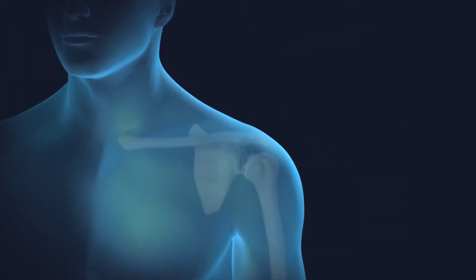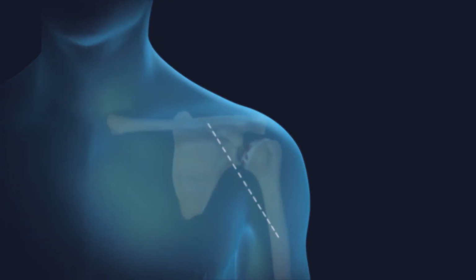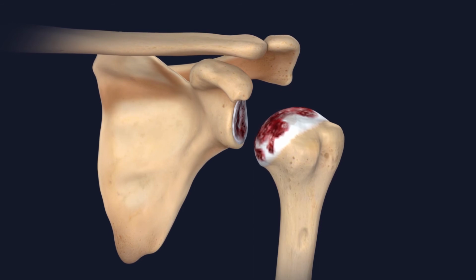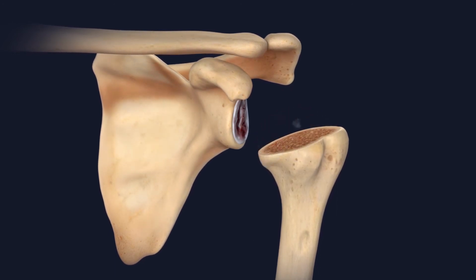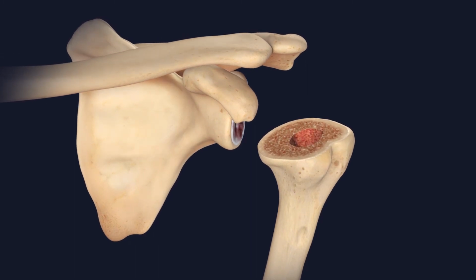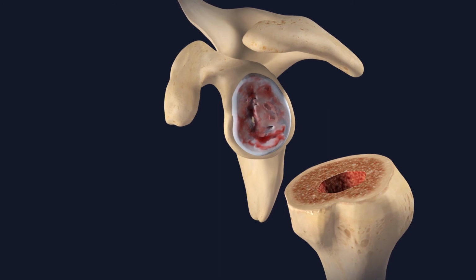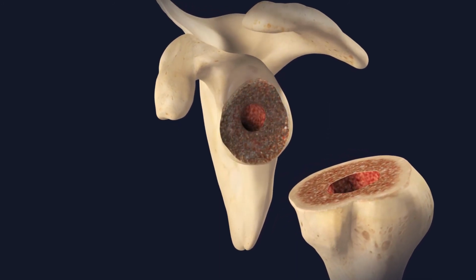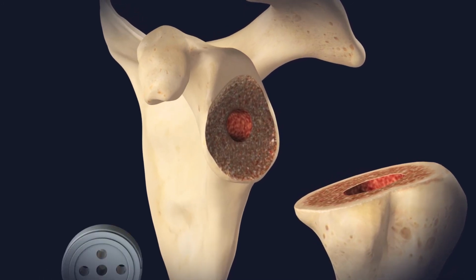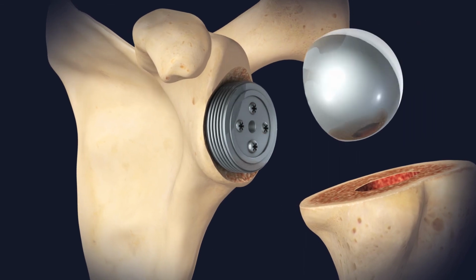In a reverse shoulder replacement, the procedure will begin with an incision over the shoulder joint. The surgeon will separate the head of the humerus from the shoulder joint and remove it. The humerus will be hollowed out in preparation for placement of the socket implant. Next, the inside of the glenoid cavity will be reshaped to prepare it for placement of the ball implant. A metal base will be attached to the scapula with screws. The ball will be screwed on to the metal base.